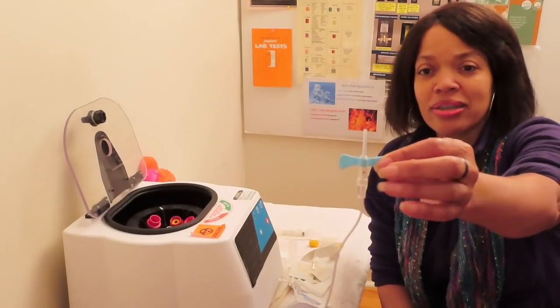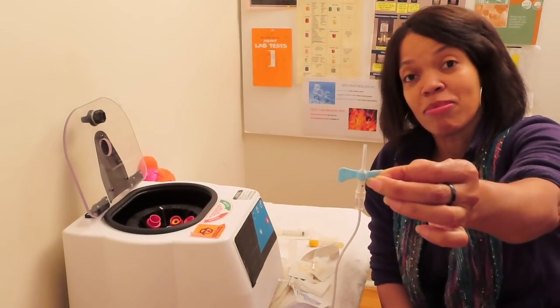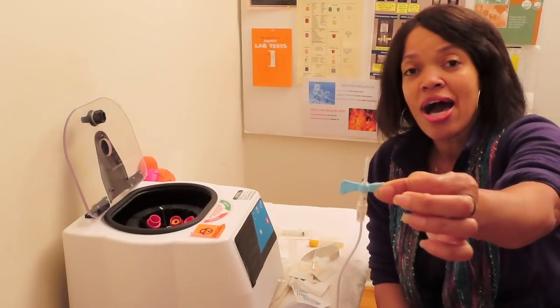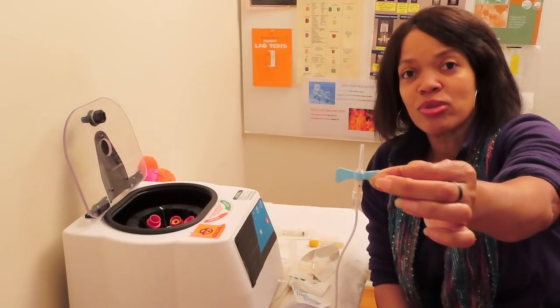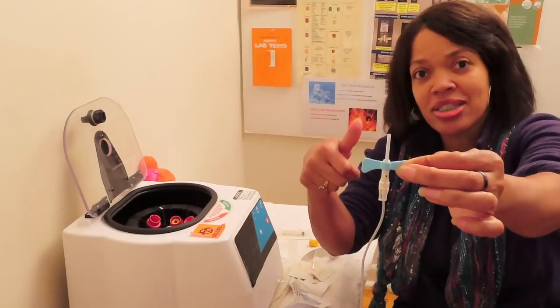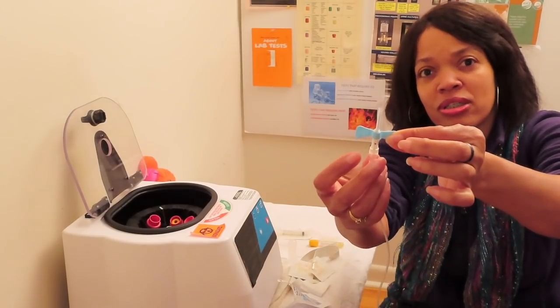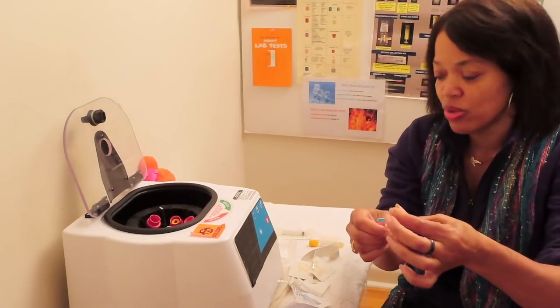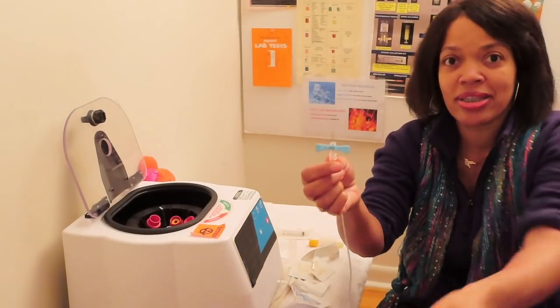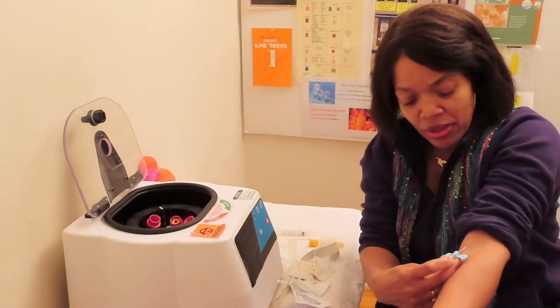I am, however, going to use the push button today because the last couple times I've stuck myself or have done a draw, I've done the lock. So we're doing the push today. So you guys know the lock slides up. This one, you're just going to push the little device and it's going to retract the needle. So I hope you guys have a really good view here.